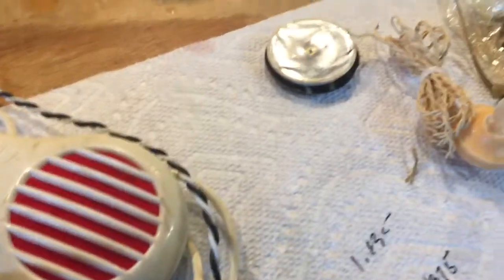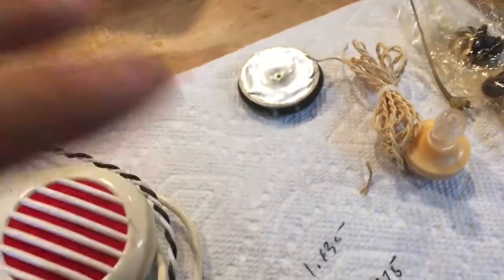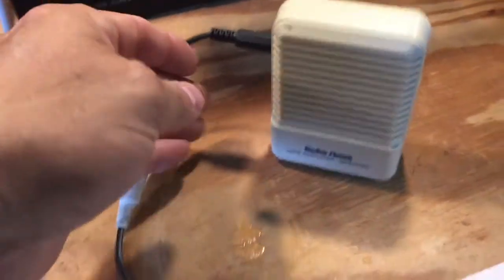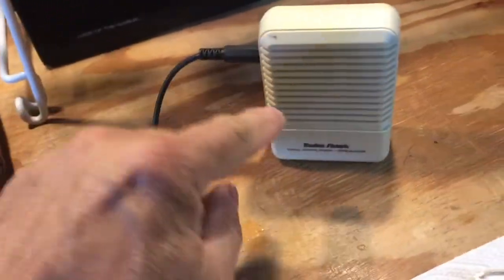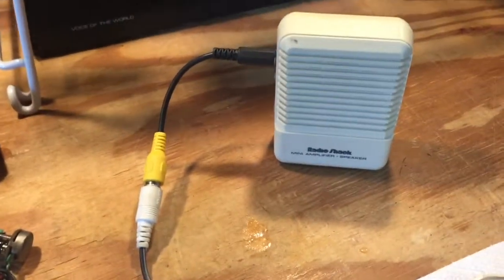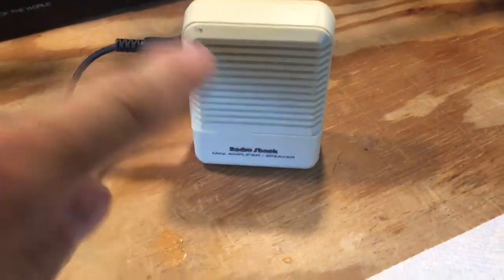I have another earphone similar to this one, but I can't illustrate earphone use on video. So what I've done is taken the connector for the earphone and hooked it up to a little simple Radio Shack amplified speaker, so you'll be able to hear the sound coming out which would normally be your ear plug.